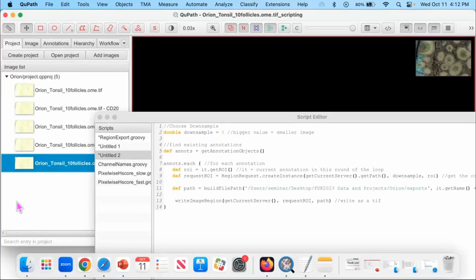You can use a classifier to find the tumor, but then you want to look at the boundary region of the tumor. So either the first 50 microns inside the tumor or the 50 microns just outside, to understand the immune reaction.